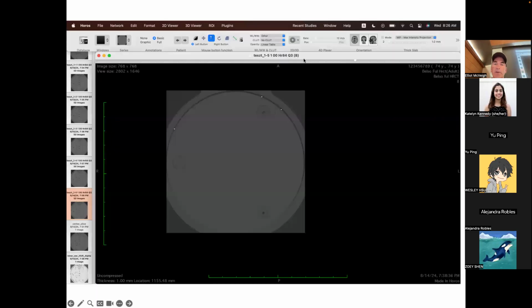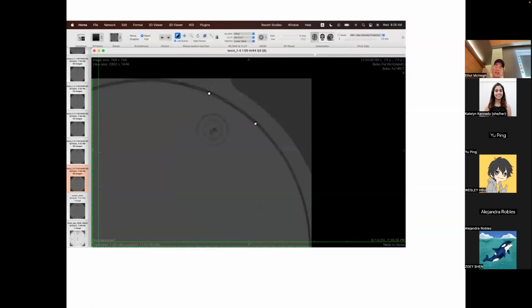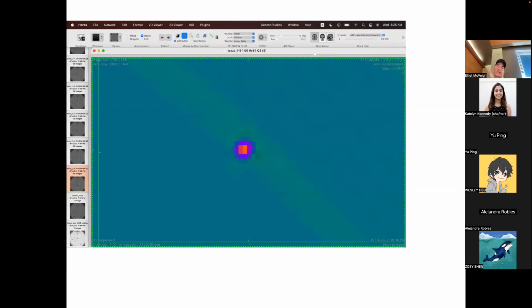So here's an example. This is another phantom. Oh, actually, this might be the same phantom. And this is in a very high resolution photon counting CT scanner, actually. Here's a tiny dot, and this is one of those ballpoint pen things. I thought they were small, but this scanner can actually resolve them, which is pretty great. So we're just going to look at this part of the field of view next. Zoom it up. Here's my ballpoint thing here. Let's zoom in closer. Actually, sorry, I'm going to change it to a color background so that you can see more details of the hump. And then we'll zoom that up, and that's what it looks like.